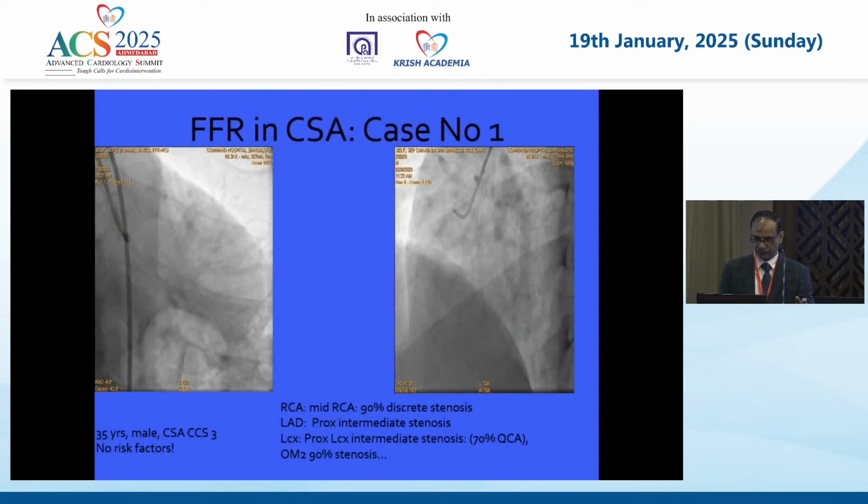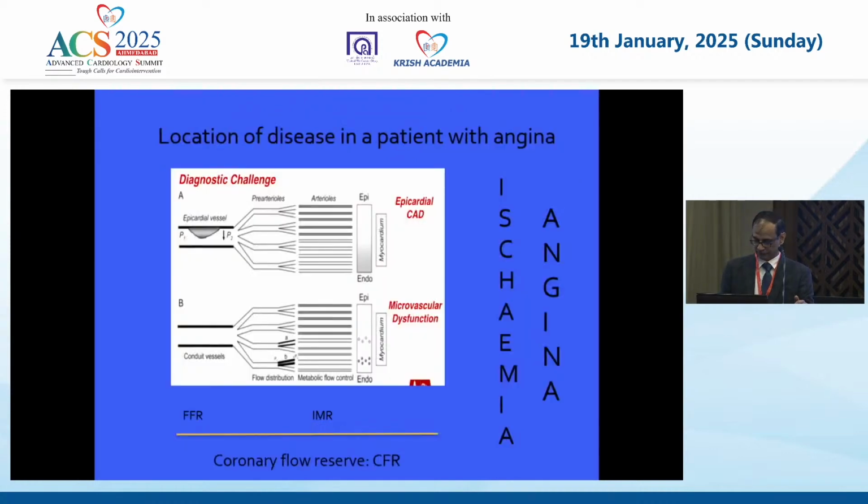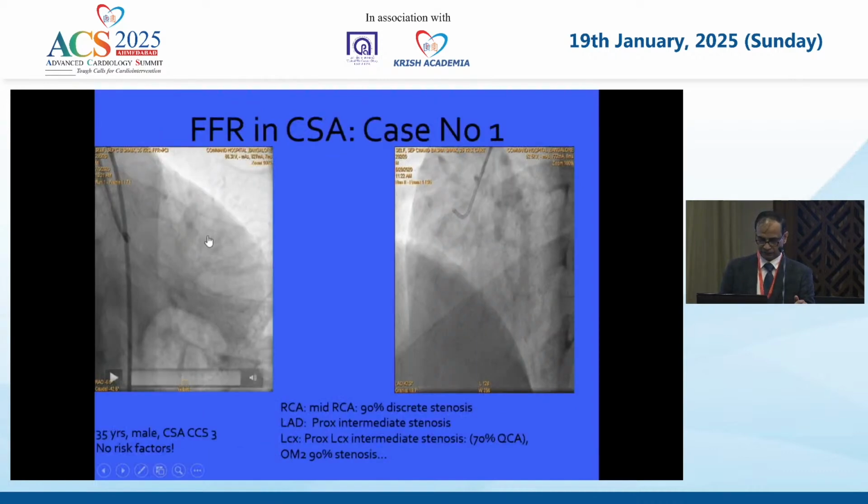The angio is not playing. It doesn't matter. This is basically a multi-vessel disease. It shows disease in all the three vessels.